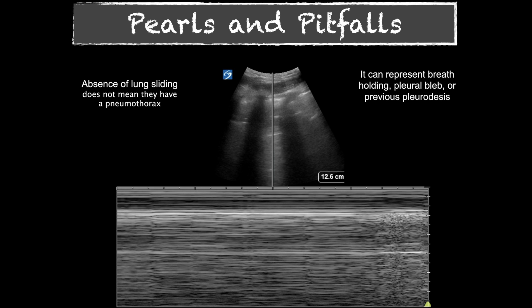This is an M-mode demonstration showing the barcode sign. Below the pleural line, we see no movement — this does not mean pneumothorax. Absence of lung sliding can represent breath holding, a pleurobleb, or prior pleurodesis. It can be a pneumothorax, but you need to search for a lung point to confirm that diagnosis.